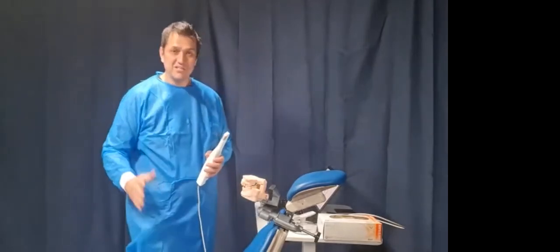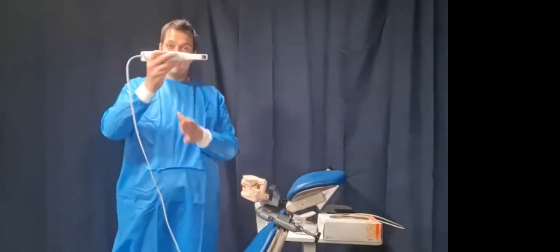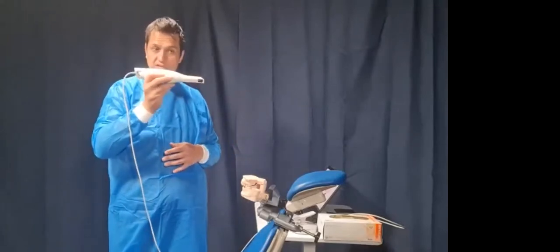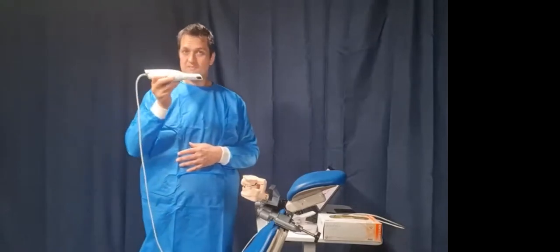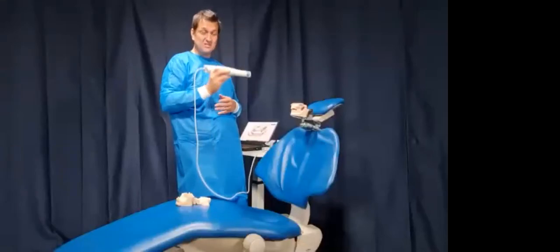Now that's exactly what I had to do with this case. It did not capture it in a couple of passes there. I had to literally start on the molars, run around the uppers, and then I came down the face of the upper quadrant 1 molars, and then I started going like this. That was my movement. So up, twist, up, down, twist, up, down, twist, up, down, twist. And then that beautiful sound came.